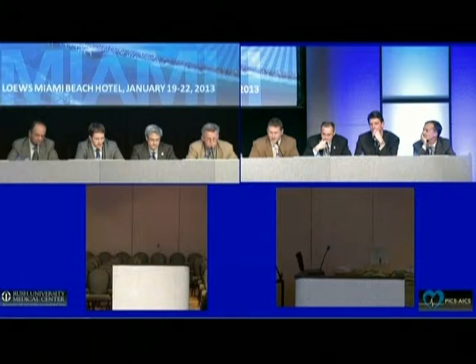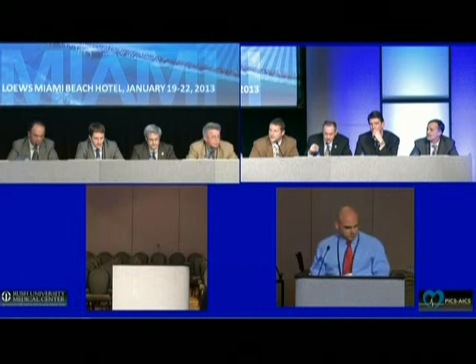Mostly the same, but I think it really depends on the case, and it clearly evolves with your experience. You know, so we didn't start that way. So I think if you're starting, it's probably not the way to start with a 3D. The other thing is I still like to get, depending on the case, the hemodynamics before we give a big dye load. So it does change your workflow.